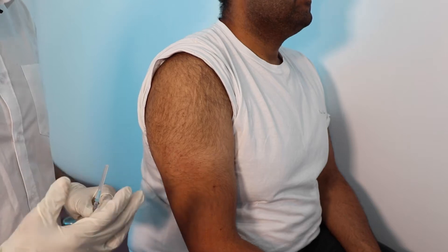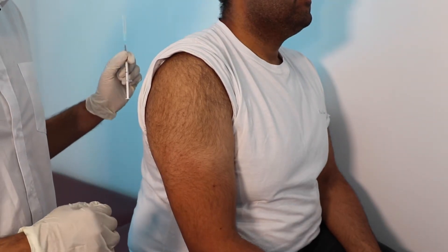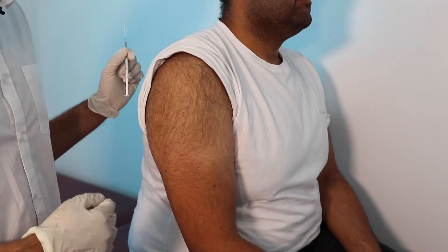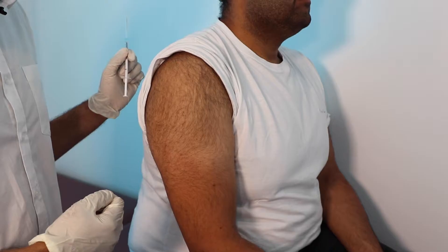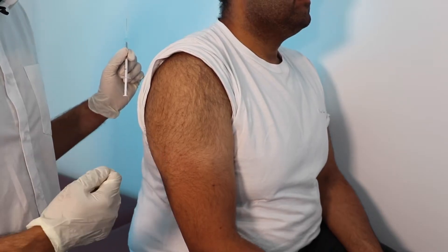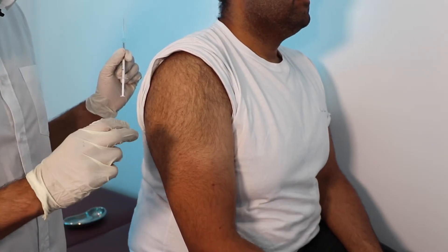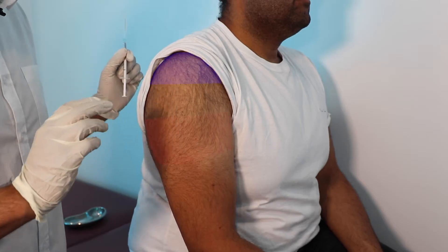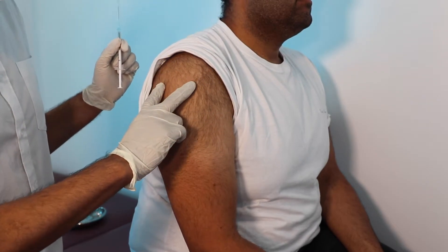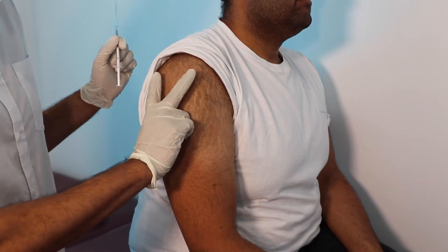The first thing that is very important is to make sure that your syringe and needle is not directly in front of the patient, as some patients can become quite anxious with the idea of having a vaccination. Secondly, it's important to identify the site that we're going to be vaccinating in, and that is done by vaccinating between the upper and the lower border and then identifying a V which can be drawn between the margins of the acromion process.